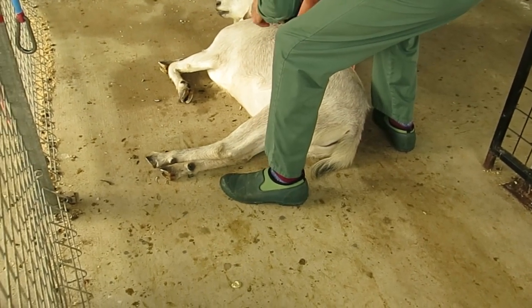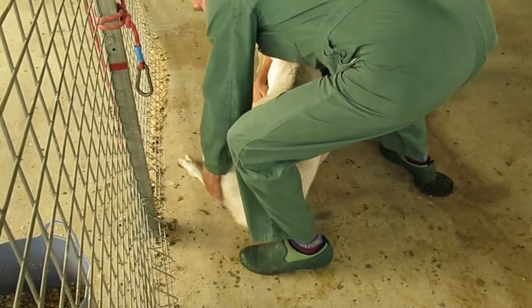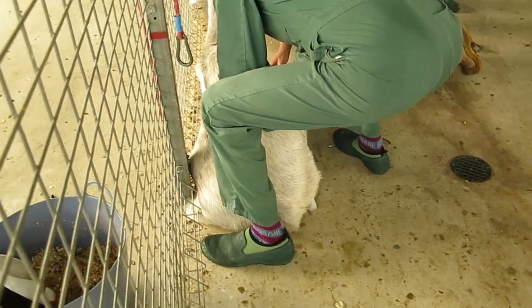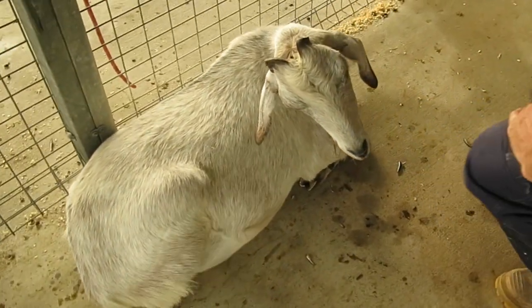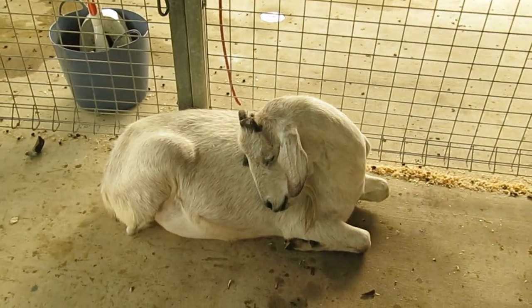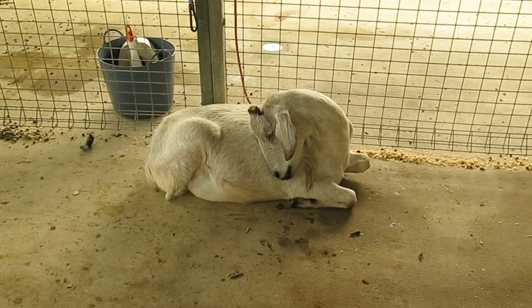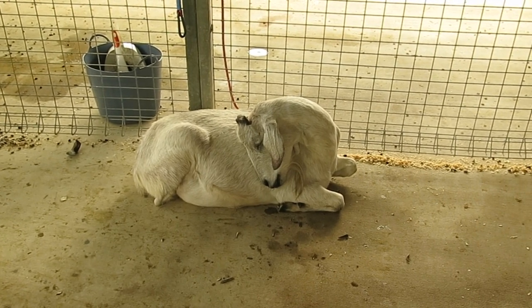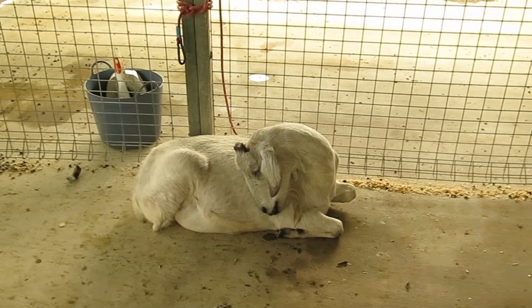The goat is now being moved into a more upright position so it doesn't bloat as it's recovering. The goat can now hold up its head and is recovering from the anaesthetic. Hopefully those horns will grow back in a different way and won't need to be repeated.